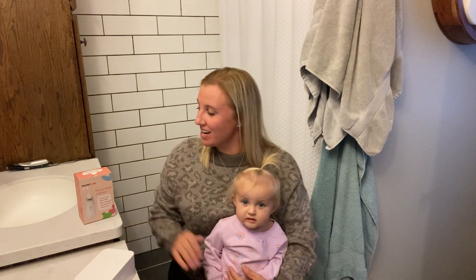Hi guys, I'm here to show you today with my mini model here this new nasal aspirator that I just got. I'm super excited to use it and it is going to do wonders for her nose when she's congested.